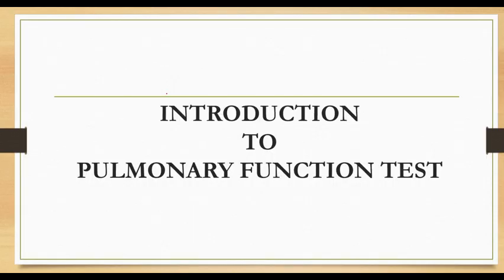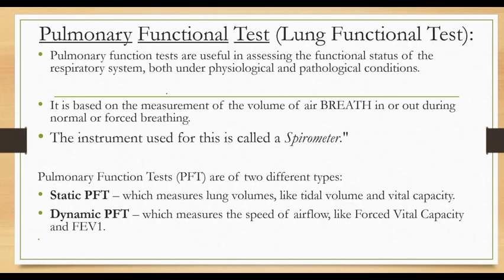Hello everyone. Today I'm going to discuss an Introduction to Pulmonary Function Test. Pulmonary Function Test is also called PFTs, meaning lung function test. It is used to measure how your lungs are working, how we breathe in and breathe out. It is very useful in patients with disease conditions like asthma. It is of two types, static and dynamic.